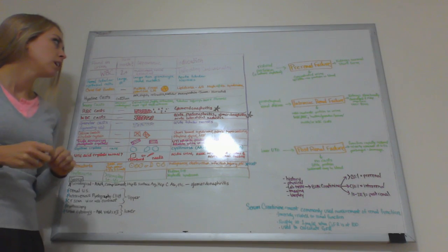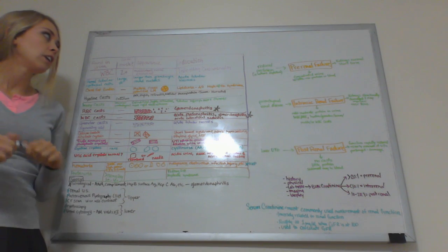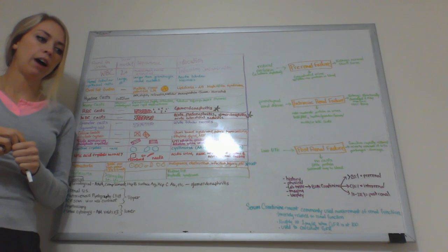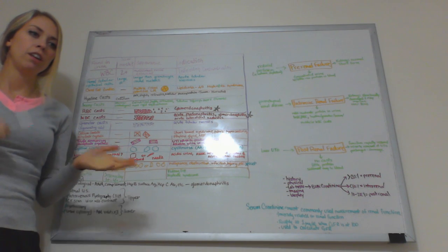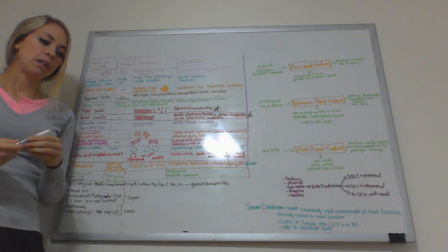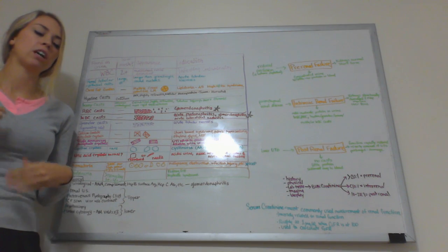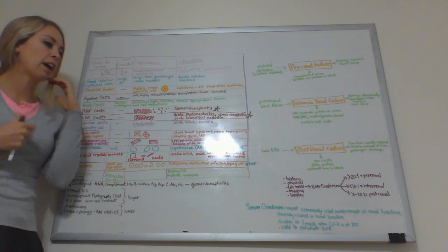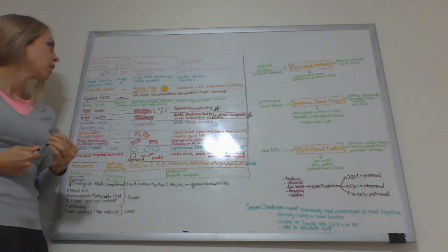They are multi-lobed and they appear granular in the urine specimen, and they can indicate that you have an infection or a contamination, especially if you have an associated inflammation or infection of the vagina or the urethral meatus of men and women. A lot of times that can get in a urine sample and contaminate it and make it look like you have an infection higher up in the urinary tract, but it's actually outside of it. So that's why you want to have a clean sample in order to properly test if there are white blood cells in the urine coming out.